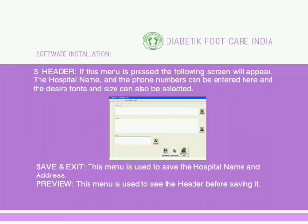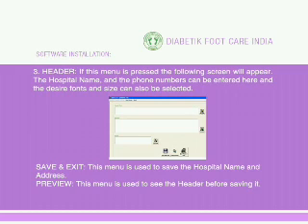Header: If this menu is pressed, the following screen will appear. The hospital name and phone numbers can be entered here, and the desired fonts and size can also be selected. The Save and Exit menu is used to save the hospital name and address. The Preview menu is used to see the header before saving it.